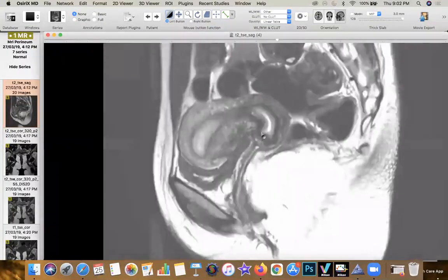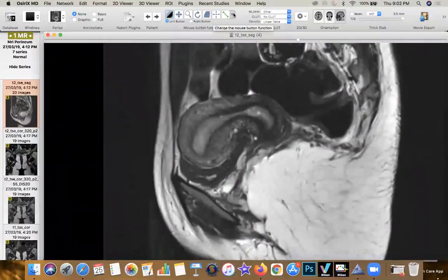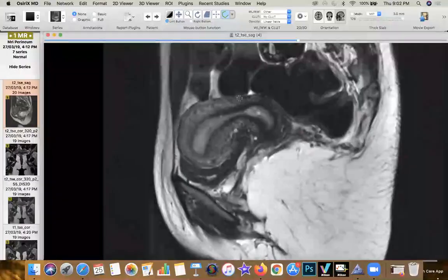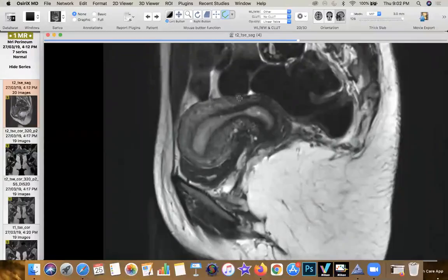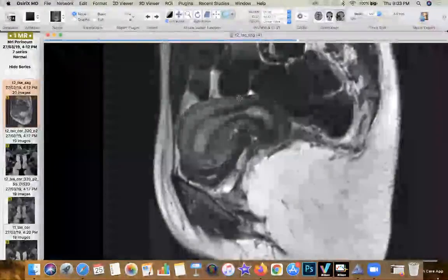What I'm going to do is, again, start off with the normal anatomy. Yesterday, when I was talking to you all, I used a very important tool to explain when you're looking at anatomical conformity of structures. It's very important, not only in abdominopelvic imaging, but whether you're doing head and neck imaging or neuroimaging, to know what is a normal appearance of a structure.